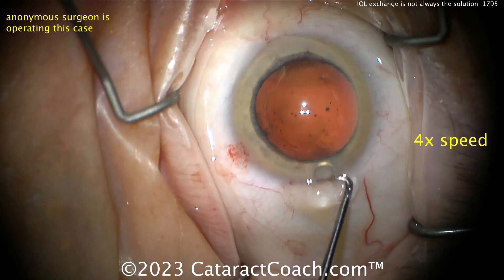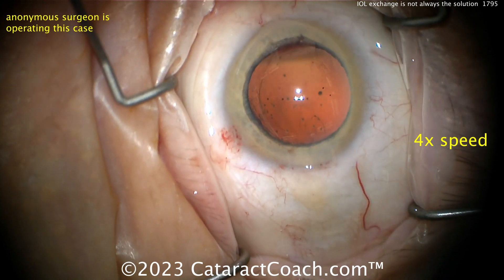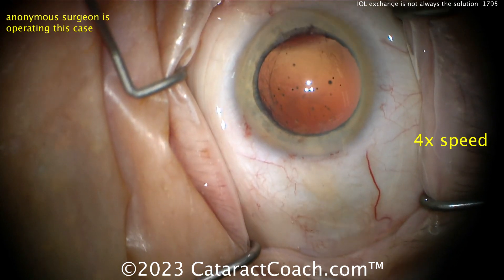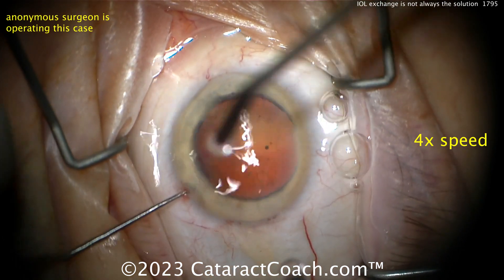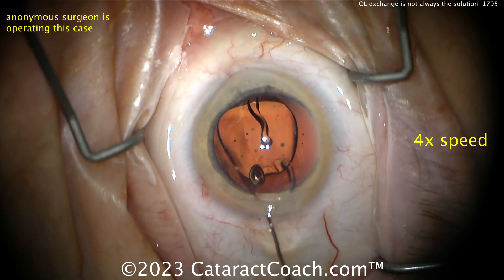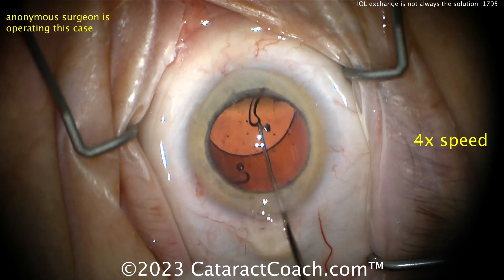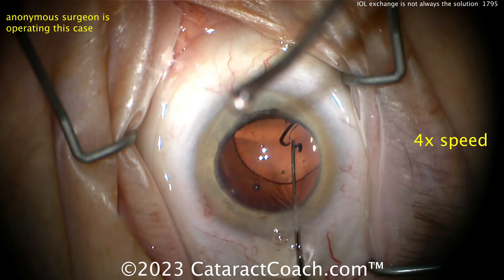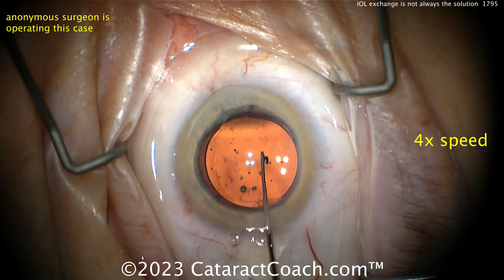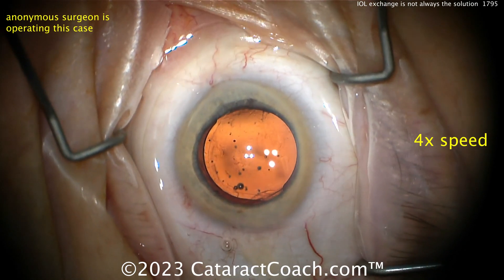You don't need to polish anymore. Now let's see what new lens is going in — is it going to be a Vivity again, is it going to be a monofocal? Here comes the new lens, and it looks like it has no toric marks. It looks like a Vivity lens as well. So you replaced a toric Vivity with a non-toric Vivity — I can understand that.